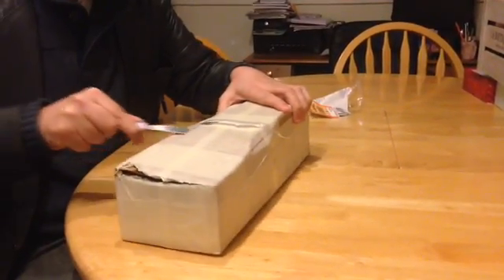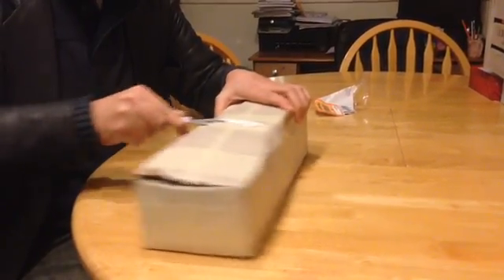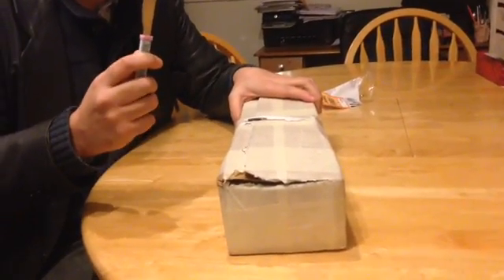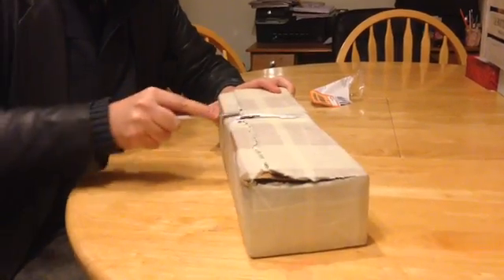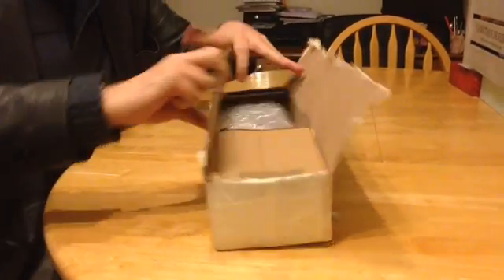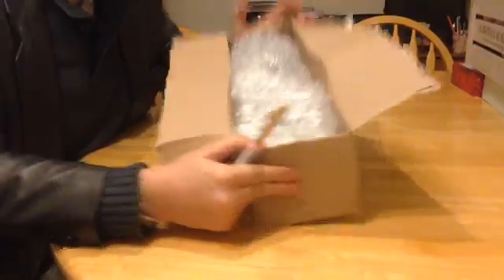I'm actually cutting it open. There you go. I'm using a Peppa Pig knife — I don't know whose this is. Is this your Peppa Pig knife, Phoebe? I do apologise for using a Peppa Pig knife. So I open it like that, and I'm going to let Joe open the rest of it. There's plenty of bubble wrap up there.